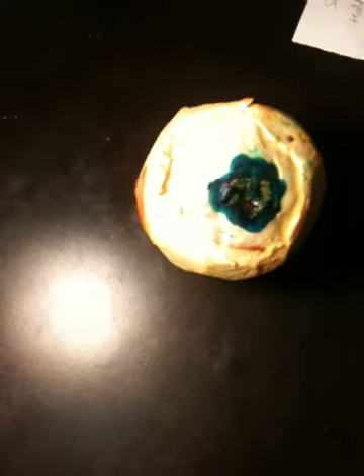So just to show you what we took out of the wound, everything's in the tissue. You can see a lot of white chunks. You can also see a lot of blue chunks, and a lot of blue dots. This is a big chunk, complete necrotic tissue with the dye. This is one of the other chunks, and this is one chunk. So this is necrotic tissue, and there are some dye particles, but majorly this is tissue. This is a little bit of tissue, and so that's pretty much it.